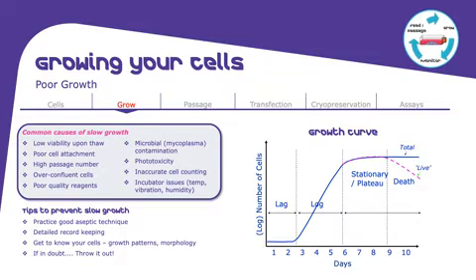Why is it important to know the cell growth curve? You will be using those cells for your application, and also you would want to freeze your cells for the future, so if you need to use those cells later on, they will be at their best. Usually the cells are collected at the end of the logarithmic phase, because this is where you have most of the cells very viable and in strong health, and not so many dead cells.